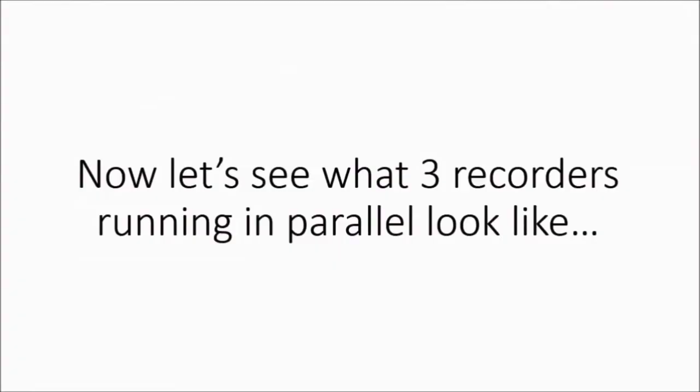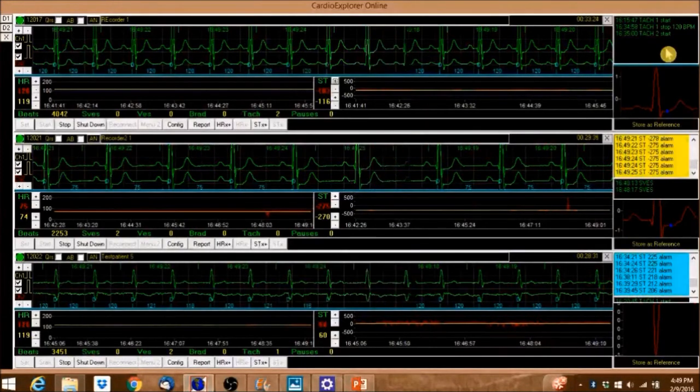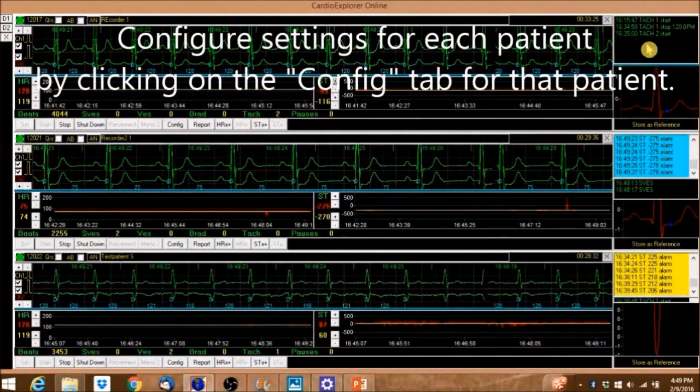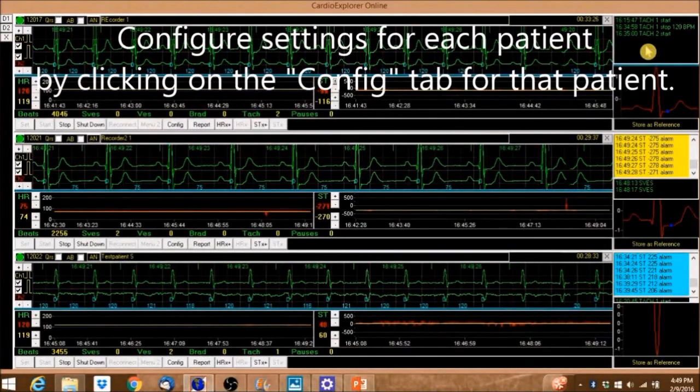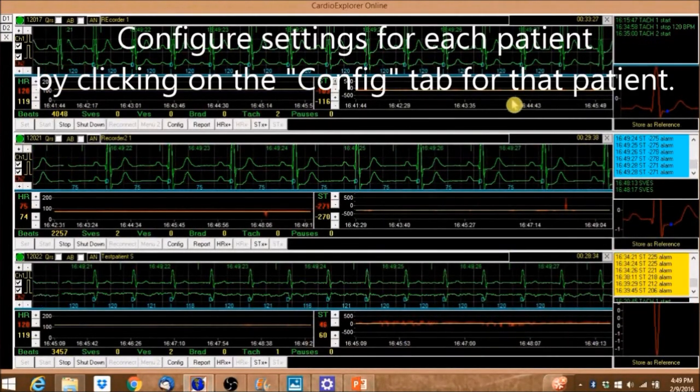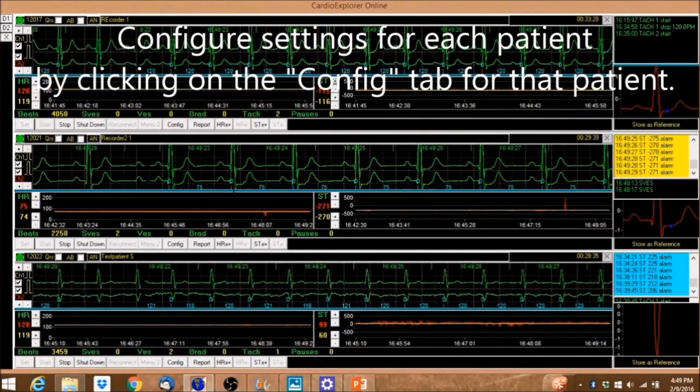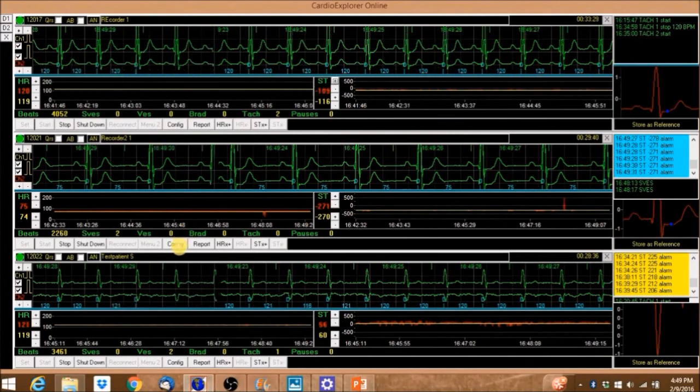Now let's see what three recorders running in parallel look like. Configure the settings for each patient by clicking on the config tab for that patient.